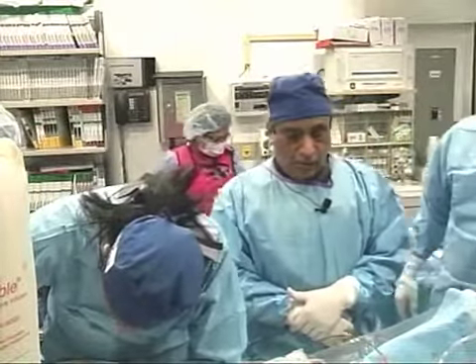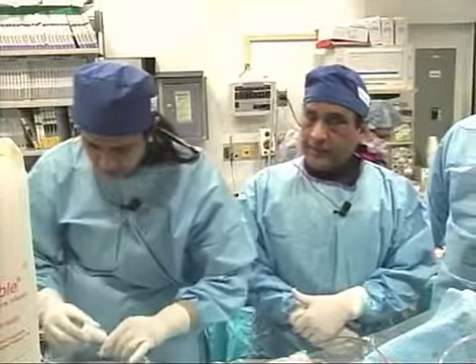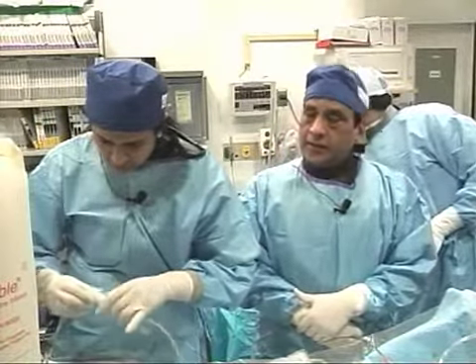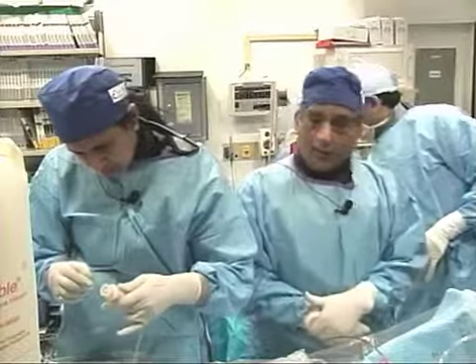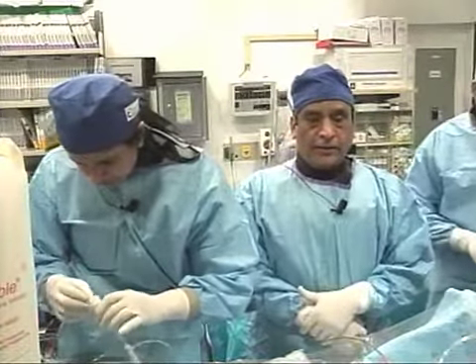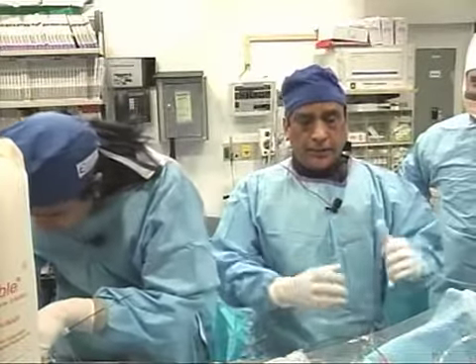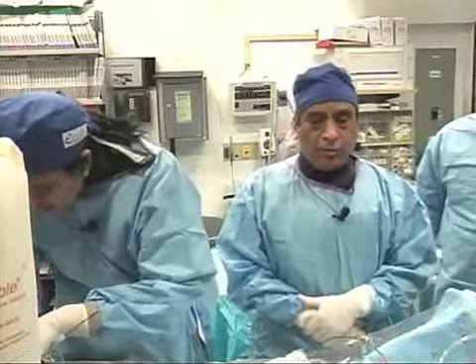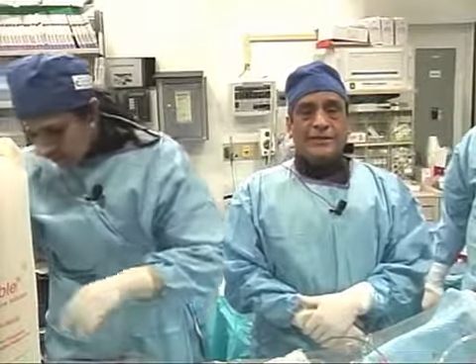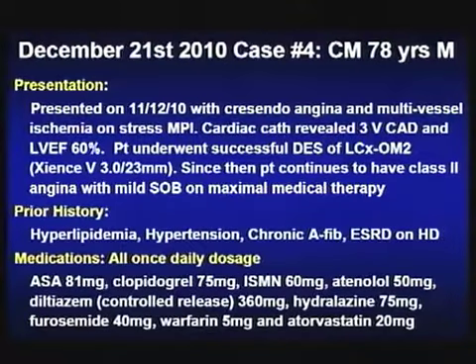With that note, I rapidly take you through this complex interventional case with my associate Anu and my fellow here, Sham and Narayanan. The interventional fellow is Sham. This case actually happens commonly, patients with multi-vessel disease: we start intervention and do a culprit vessel and then bring the patients back for further intervention.